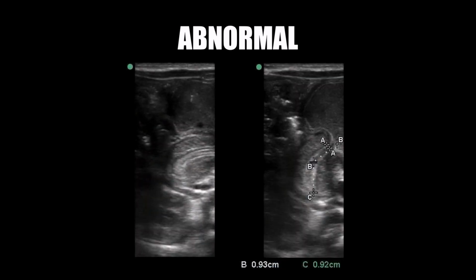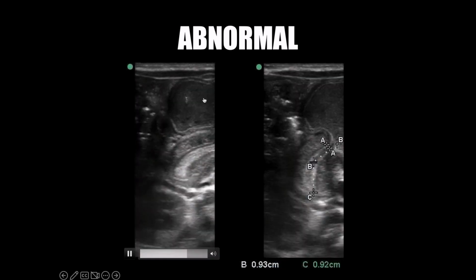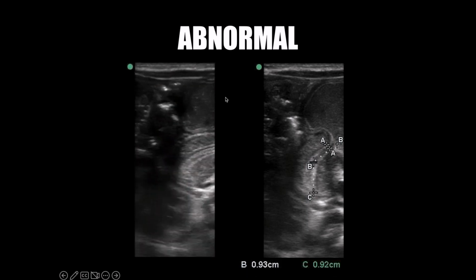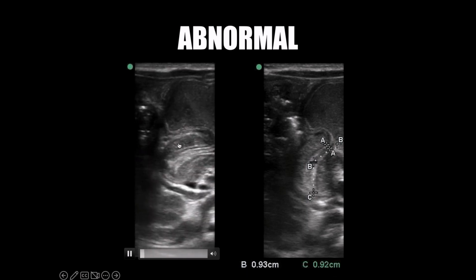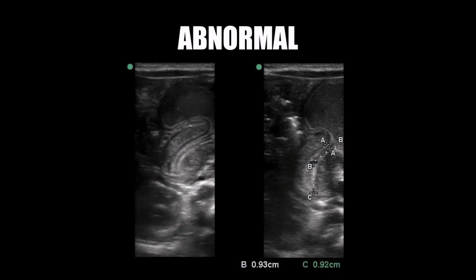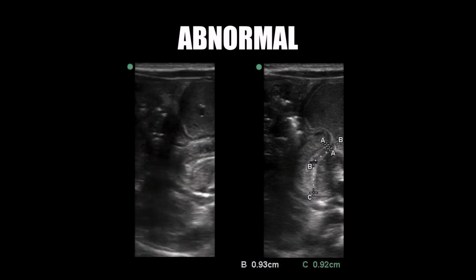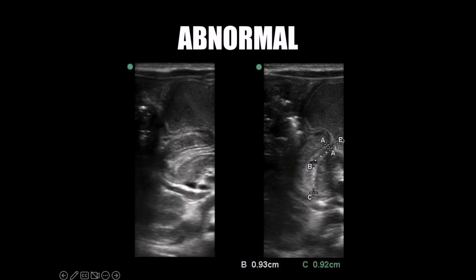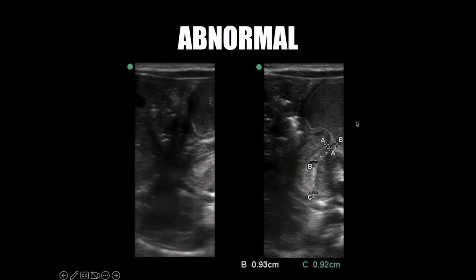Another example of abnormal here. Again, the video on the left, you can see big distended stomach, fairly hypoechoic, homogeneous gastric content. See the stomach sort of squeezing along. This pylorus is thickened. Nothing is making its way out of that channel. And you can see on the right, we threw some calipers on. B and C collectively are measuring a pyloric channel, as we were just discussing, since that's nice and curved. In this case, chose to measure it in two different pieces. And then A is actually measuring something completely useless.